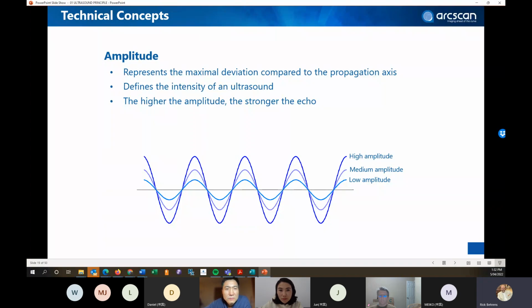That means that there is something there that is not so clear. Something dense could be a piece of brick, an IOL, a vessel, or the sclera wall. Another thing could be a tissue or blood or something softer. Okay.